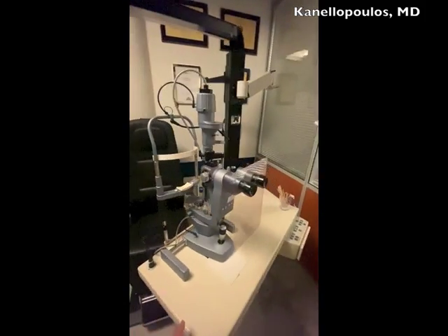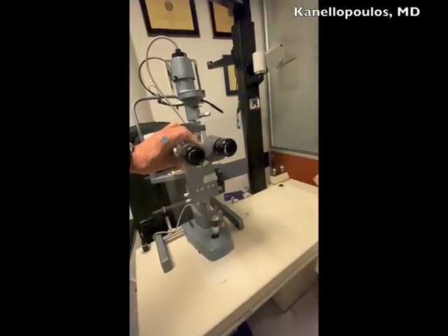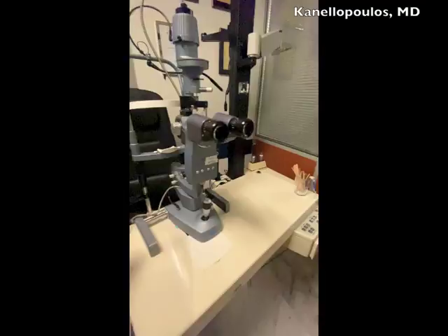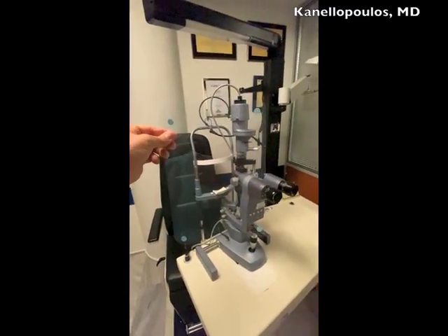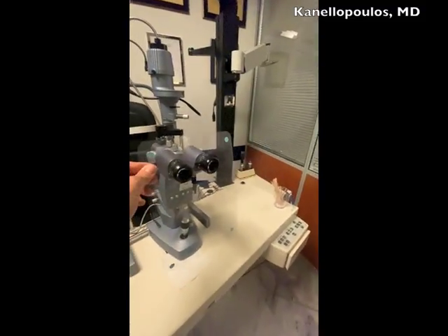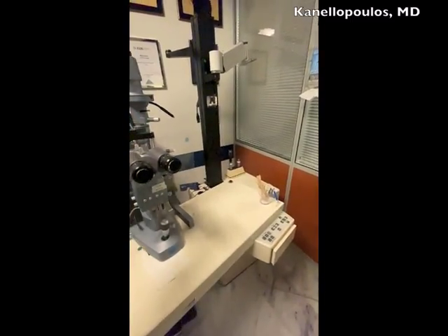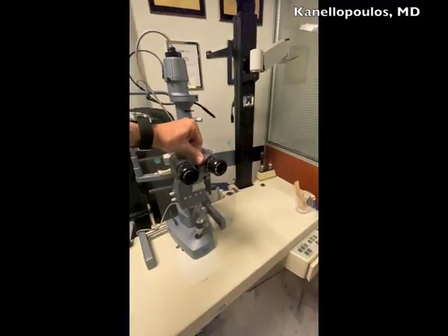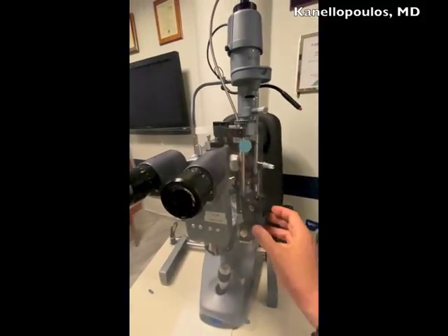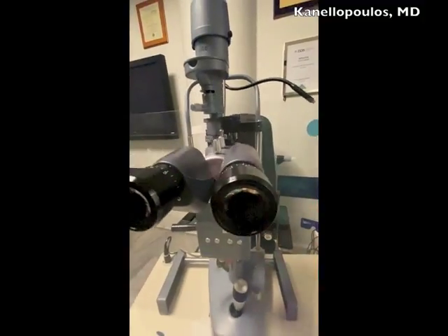These are the CSO slit lamps, beautiful pictures, and same trick here, adjusting the pupillary distance and using this very easy self-made shield from a cellophane, letter size, a pair of scissors, and the parameters I mentioned to you. Again, I'm going to narrow the pupillary distance, place our shield in place, and then adjust it accordingly. Again, intraocular pressure measurement. I'm going to switch hands here on my iPhone. I apologize. All the measurements, all the settings can be done very easily with the hand moving around the shield.